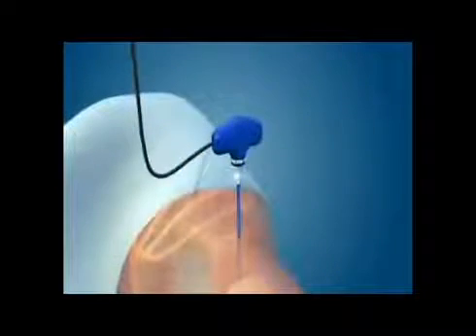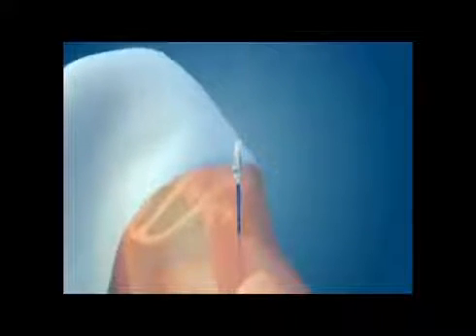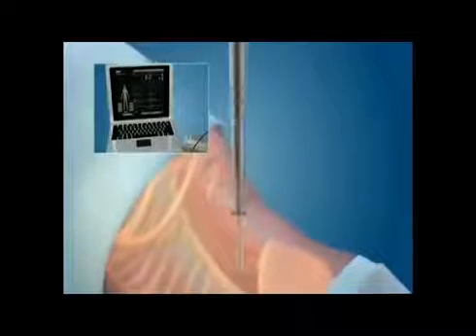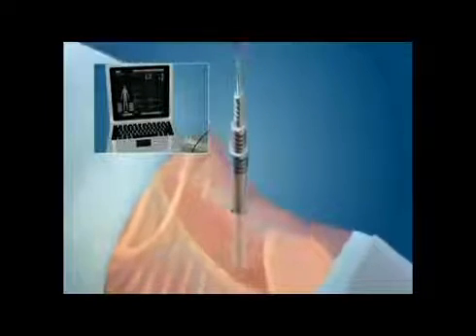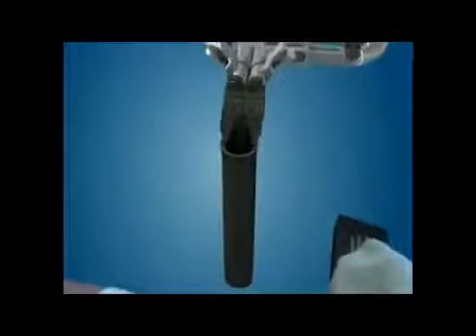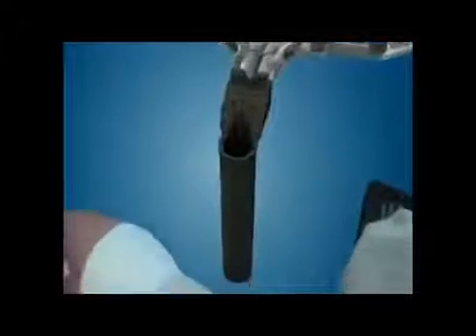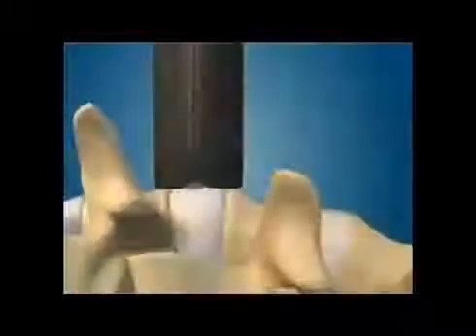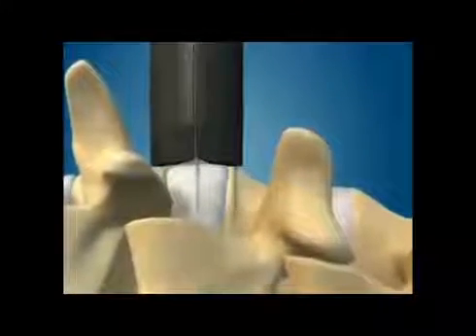An access probe is inserted through the psoas muscle using spinal monitoring to avoid injuring any nerves. Once the probe is in place, a guide wire is inserted and the tissue is gently dilated to retract the muscles out of the way. This allows for the placement of a viewing port, which is inserted over the dilators and directly down to the spine. Spinal monitoring is used again to make sure there are no nerves in the field.